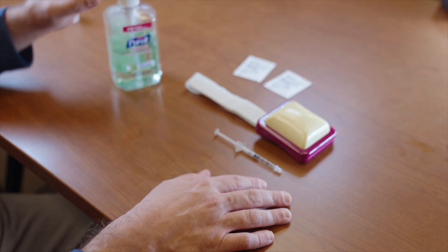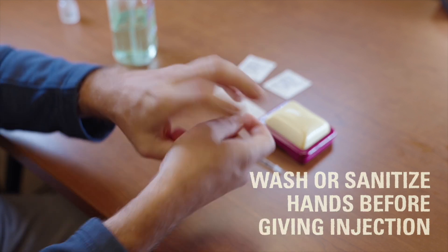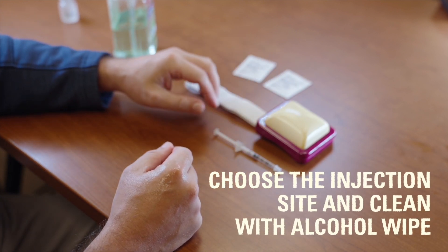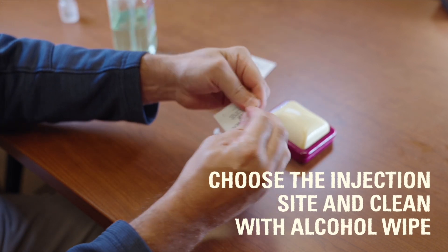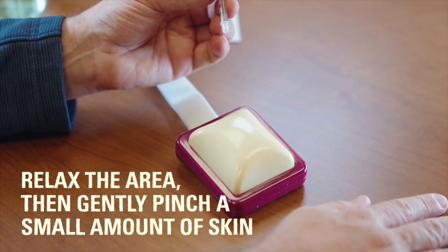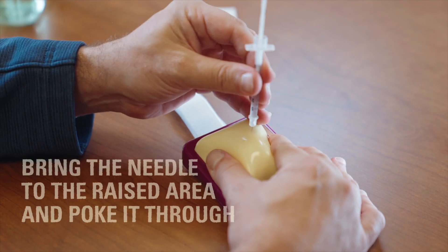Be sure you have clean hands before giving an insulin injection. To give the shot, choose the site you will be injecting and ensure the area is clean by wiping it with an alcohol wipe. Relax the area first, then pinch a small amount of skin between your thumb and forefinger.